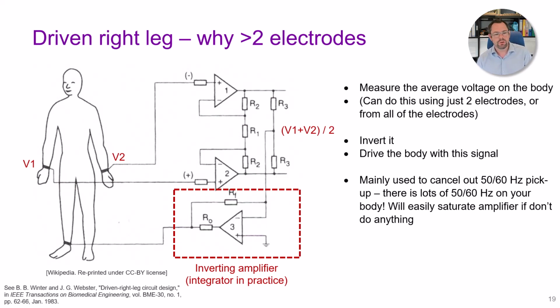What we've got on the screen here is a drawing of an ideal case electrophysiological recording. It's for ECG in this case, but that's just where we've chosen to put the electrodes. Now, in reality, of course, around me right now, there's lots of electronics, and probably around you as well, because you're watching this on a computer.